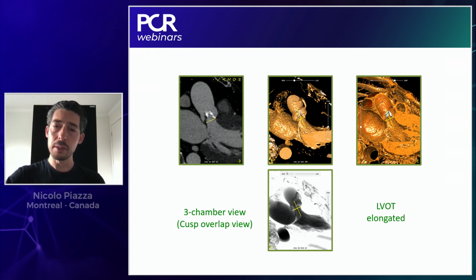Now, although we don't have enough time to discuss this, the cusp overlap technique is very closely related to the double S curve. The double S curve was a technique that we developed about 8 to 9 years ago, where we get two coplanar views of the delivery catheter. We use the pre-procedural aortic annulus S curve. We put together the S curve of the delivery catheter and the S curve of the aortic annulus, and where these S curves intersect, it gives us the view where the aortic annulus is in plane and your delivery catheter is coplanar to the X-rays.